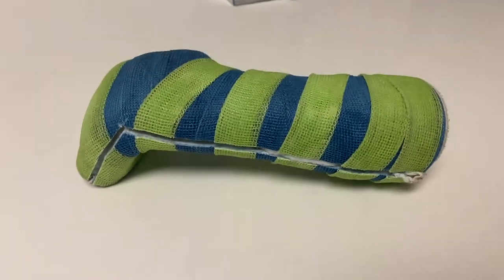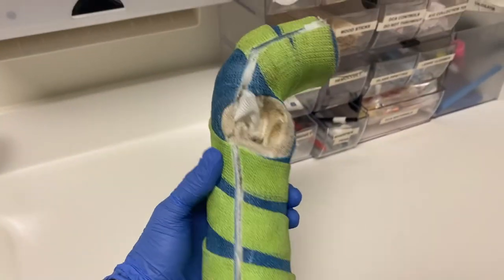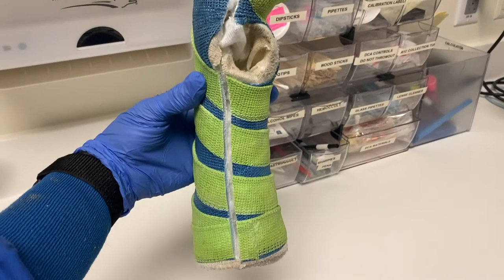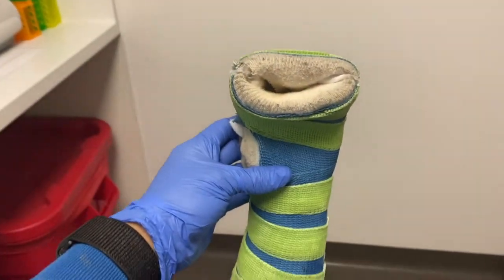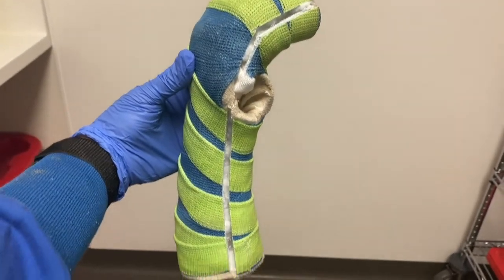Our first cast removal of the day is a short arm cobra cast. This type of cast is applied to metacarpal fractures. It's actually pretty uncomfortable because all the fingers are included except the thumb, unless the provider decides to include it. This cast is easy to do but really uncomfortable for the patient. Comment down below if you've ever had a cobra cast, because it looks really difficult to do daily life things.